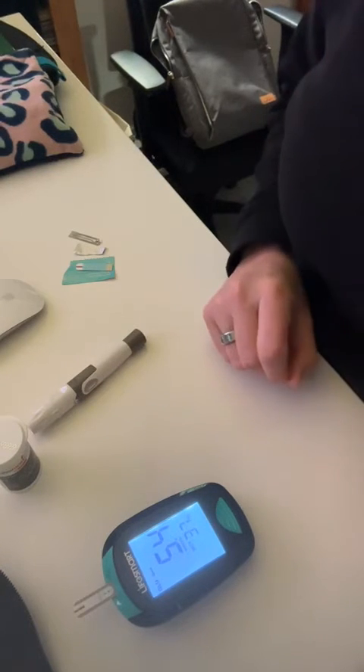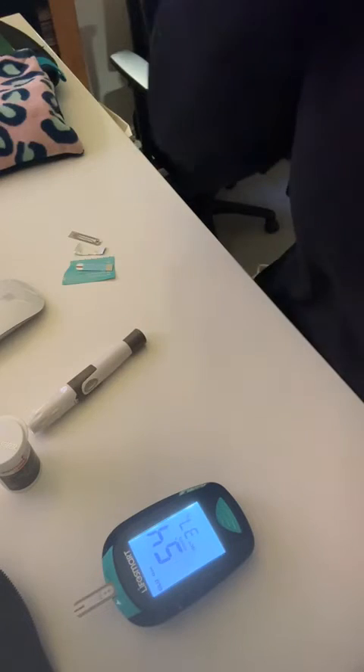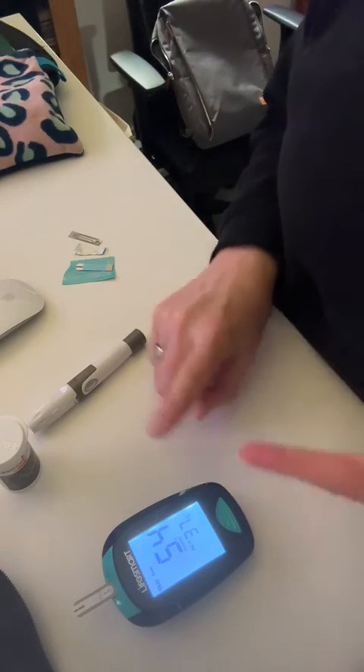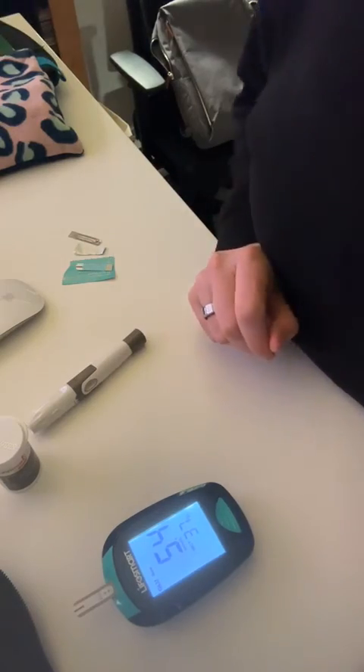Then you actually just plug these numbers into a calculator. I use Carb Manager on my phone — it's an app where you can record your glucose and your ketones and it works out your GKI for you.